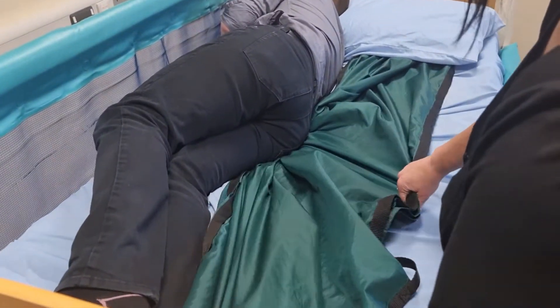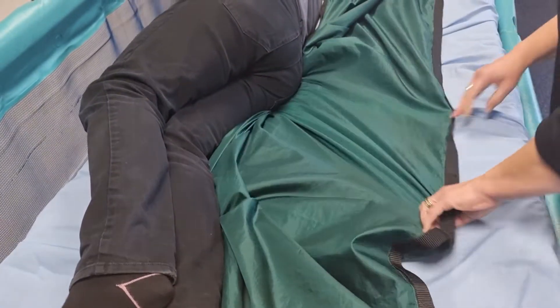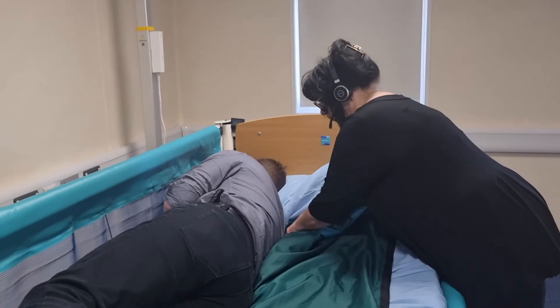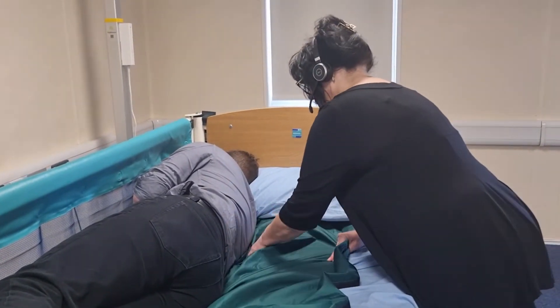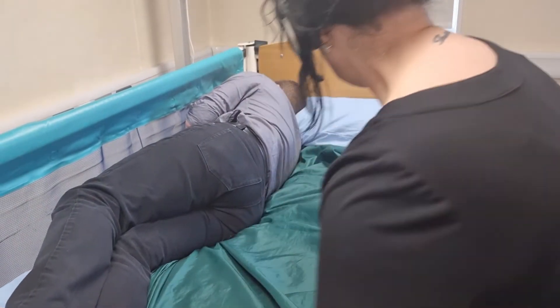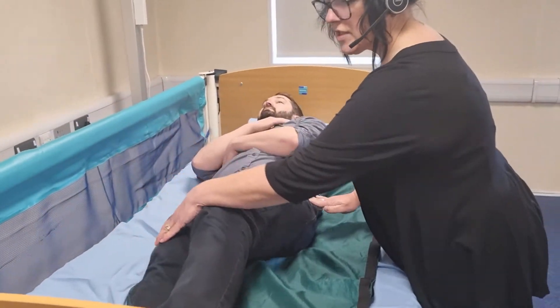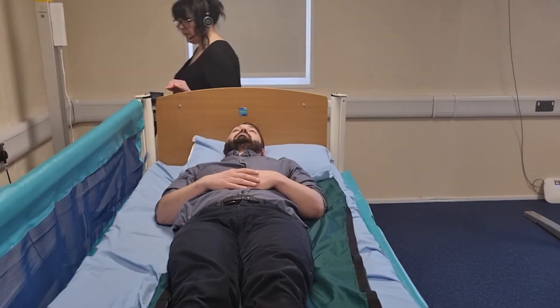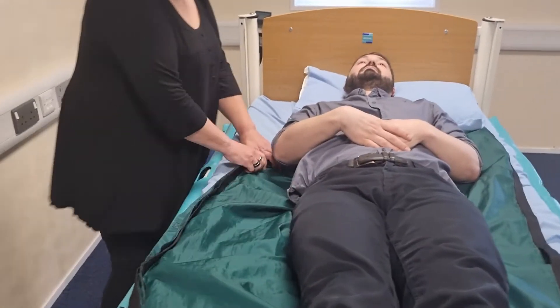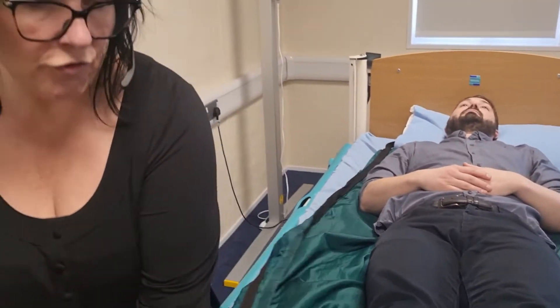Make use of the softness of the mattress. There we go, and then we can ask or assist the person to roll onto their back. Then we just simply tease the other side of the slide sheets out. If you've fitted them well and made use of the softness of the mattress, you won't have to roll the person a second time.